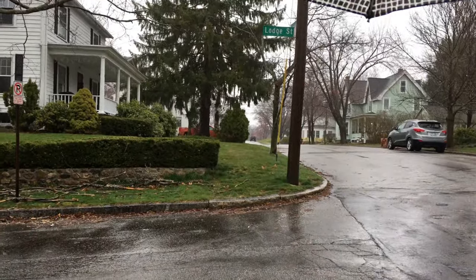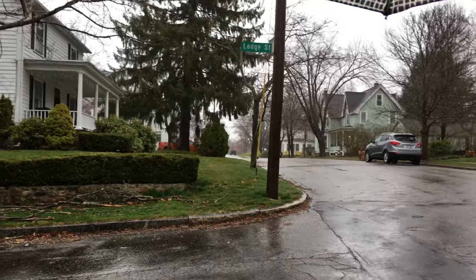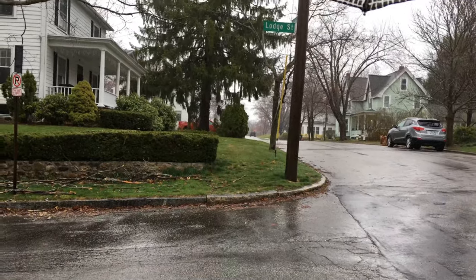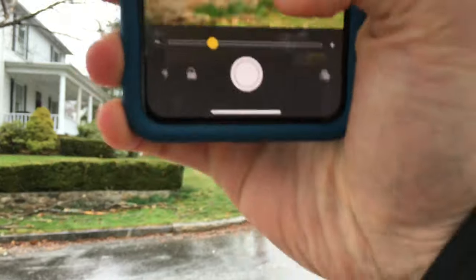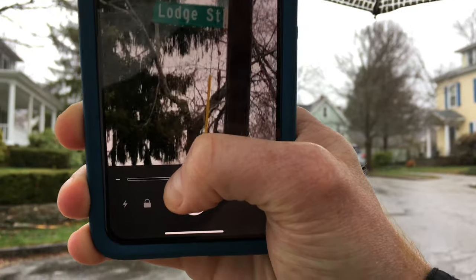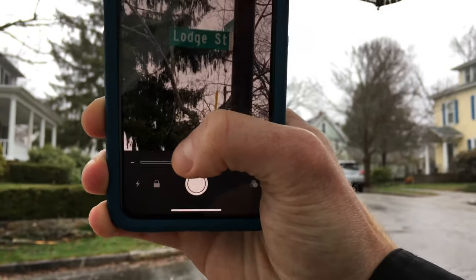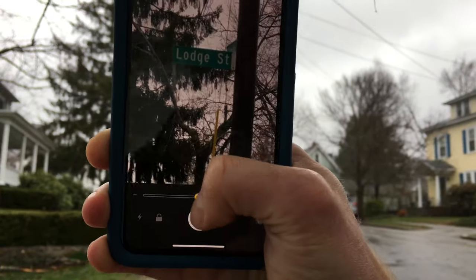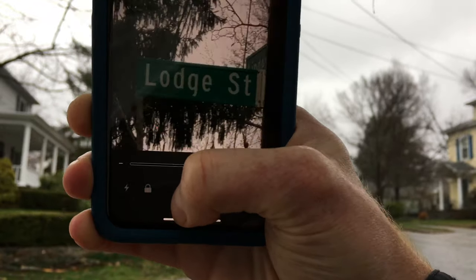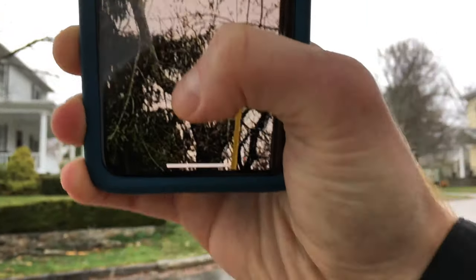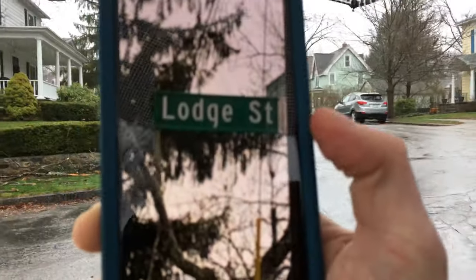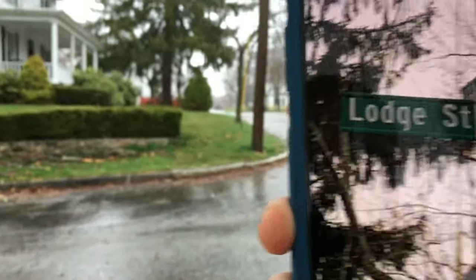Another good example is to use the magnifier as a way of checking street names or street signs. Across the street there's a street sign. Once I lock onto the street sign — it helps to follow up the pole — I can find the street sign and see it says Lodge Street. I can zoom in more if I need to, change the contrast, lock it so I can zoom in more, or save the picture. That's another good way of using the magnifier to read street signs.